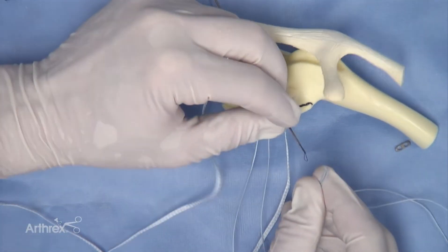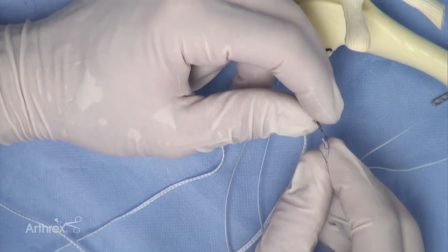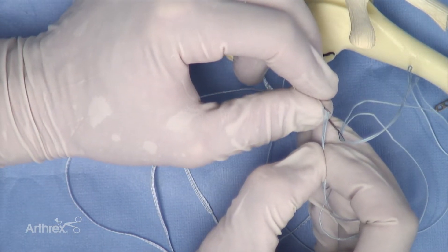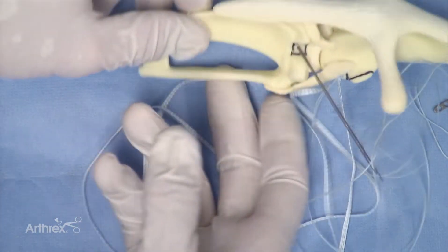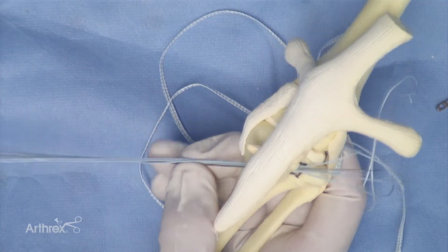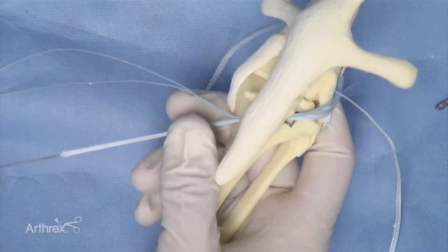Both strands of the number two fiber wire will be placed through one of the nitinol loops, and both strands of the two millimeter fiber tape will be placed through the other nitinol loop. The nitinol loops are then retracted through the tibial tunnel — first the number two fiber wire and then the two millimeter fiber tape.